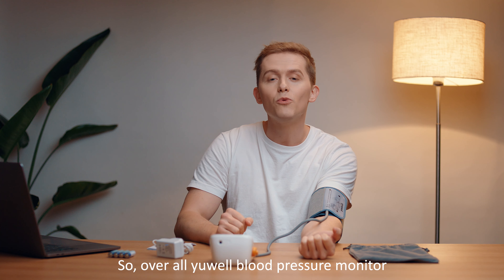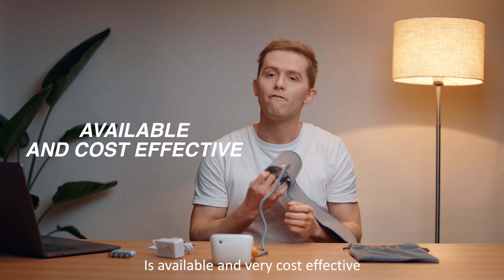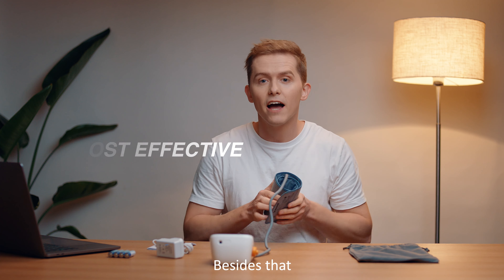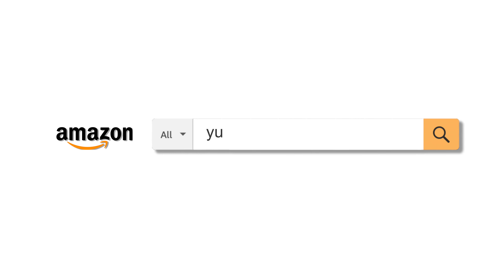Overall, Uwell's electronic blood pressure monitor is a reliable and very cost-effective product. Feel free to check out Uwell's other health-related products on their Amazon store.